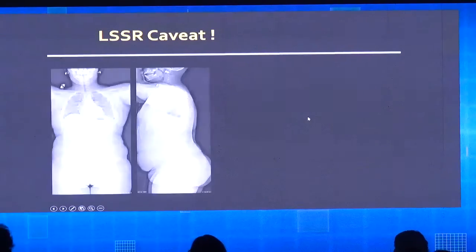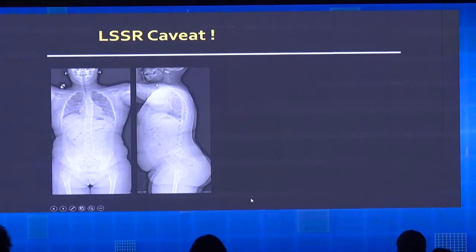There is one caveat, which is that the surgeons are so enthusiastic that any patient requiring any imaging, at least in my institution, ends up having this EOS imaging. And it's something which I have to fight to some extent, because when the patient is in pain, it could be something else, and I would strongly prefer to have segmental views of the thoracic spine and segmental views of the lumbar spine. They ask for that. So this patient has scoliosis, question mark, back pain. Any comment?